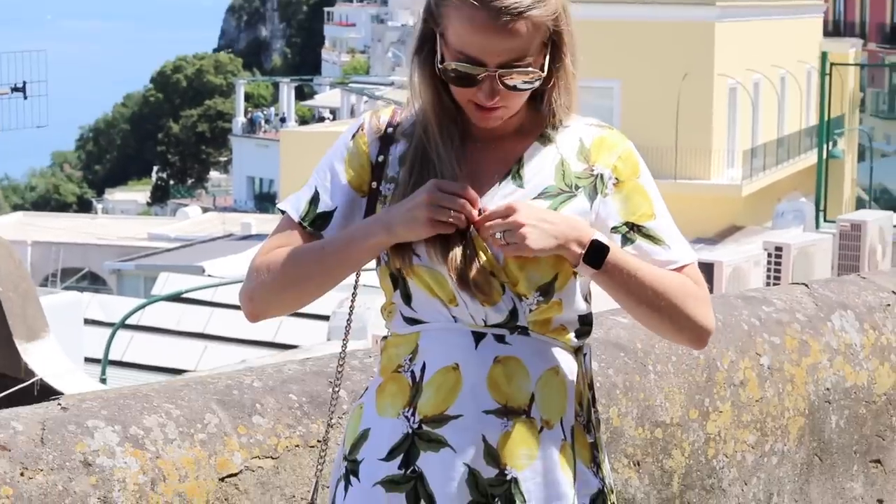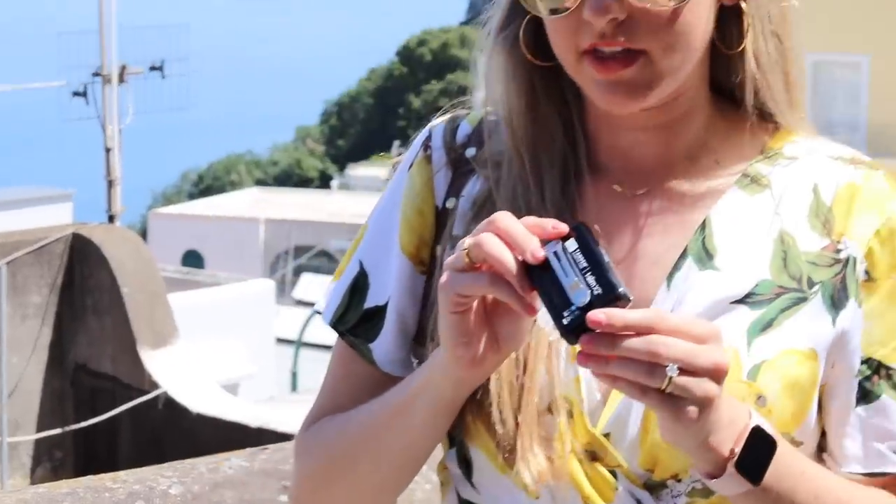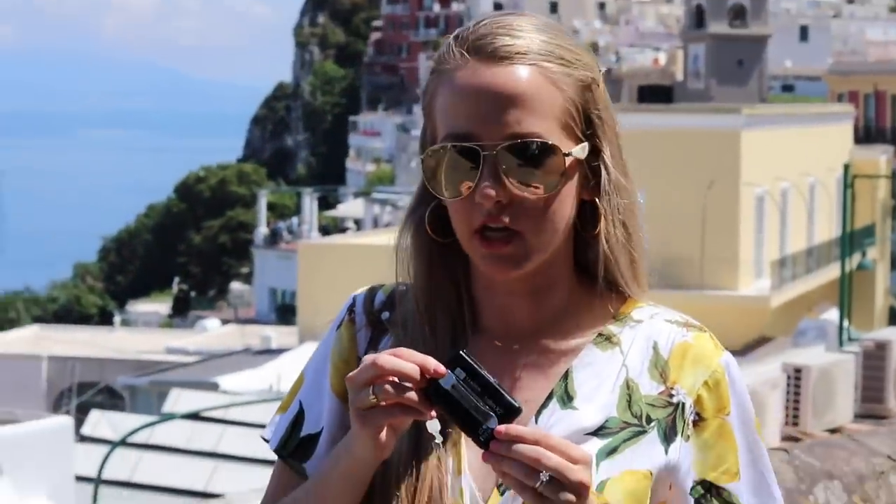My insulin pump is clipped here to the middle of my bra — I have a little snap that I can undo to take it out, and I have this clip on my insulin pump that I got from Amazon.